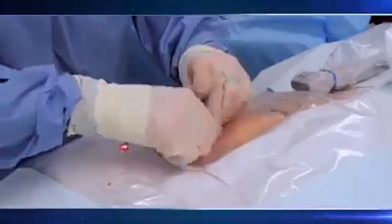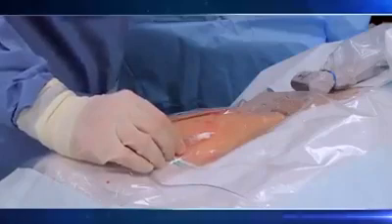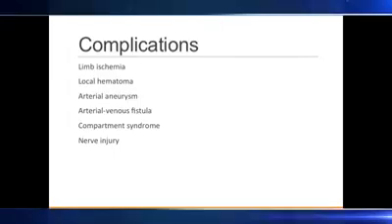and then finally connect the pressure tubing and suture the catheter in place and cover it with a sterile adhesive dressing. Recheck for warmth and color in the extremity after the procedure and on a regular basis thereafter, and remove the catheter as soon as it's no longer required.